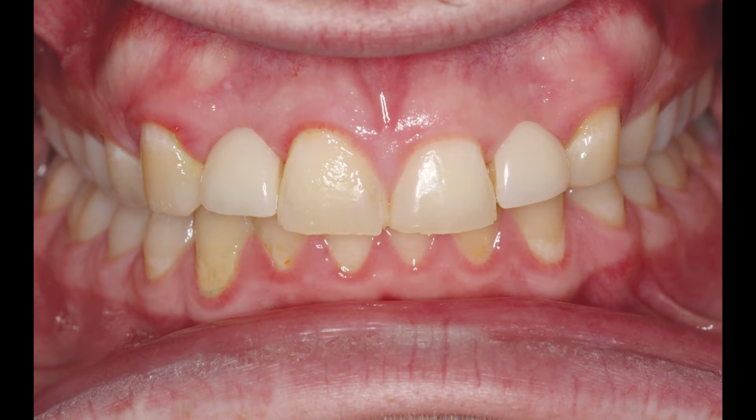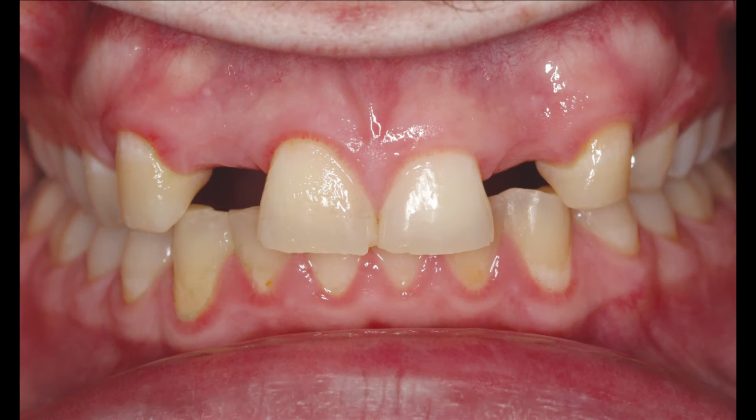The patient here is a 25-year-old male with no medical complications who presented with congenitally missing maxillary right and left lateral incisors, replaced with a removable partial denture that the patient found unsatisfactory. The Hahn tapered implant system, with its pronounced thread design and ability to accommodate tight anatomic spaces, was selected to restore the edentulous sites, as minimal horizontal bone was present.